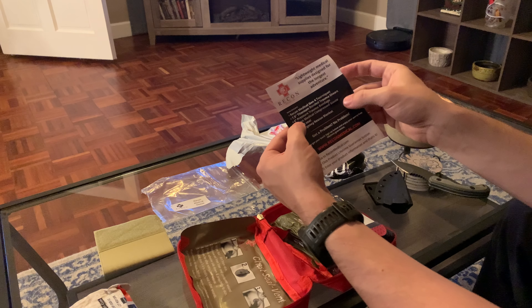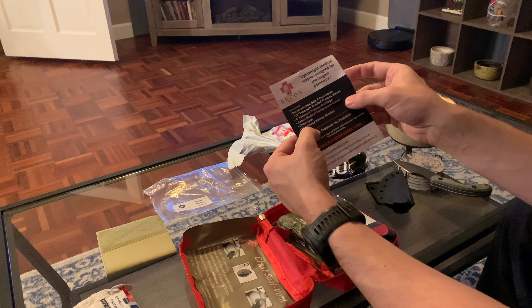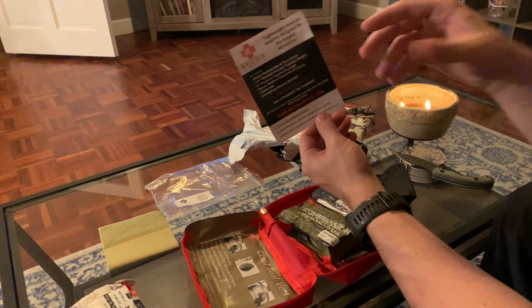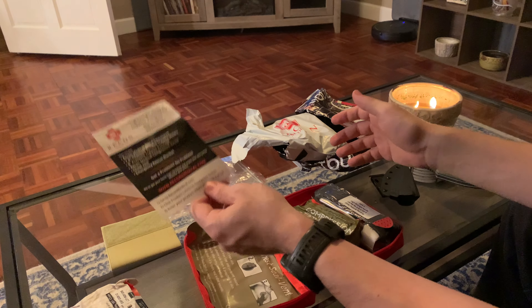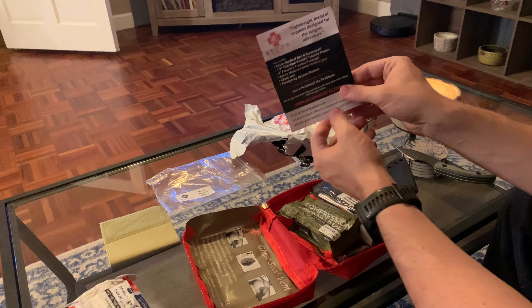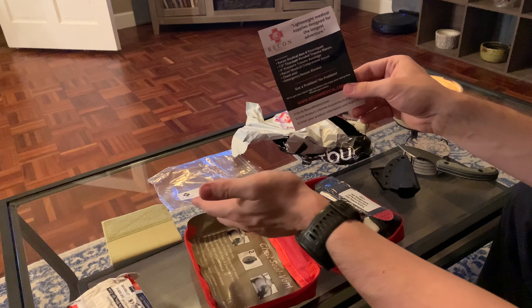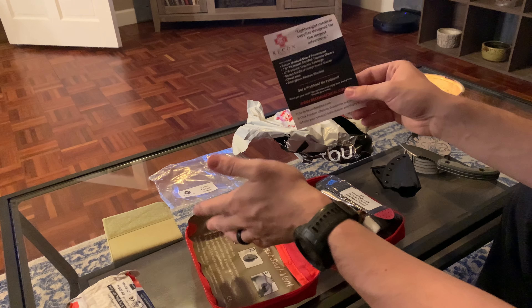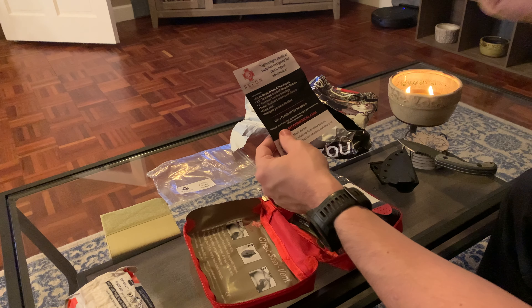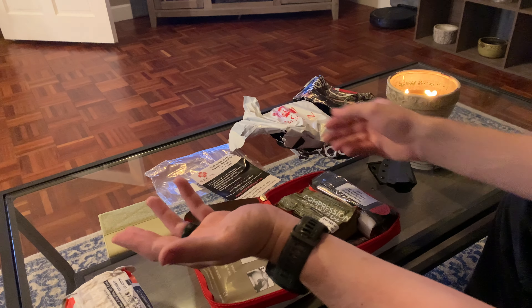There's a little card from Recon Medical — 'Thank you for your order, leave us a positive review.' Most definitely, I will be doing that. If you got a problem, no problem — get in contact with them and they will help you with everything. Sign it below and you get a worry-free lifetime guarantee. That's awesome — a lot of places don't do that anymore. So this comes with a Recon Medical Gen 4 tourniquet, 7.5-inch titanium bonded trauma shears, 4-inch pressure trauma bandage, Recon Medical compressed gauze, chest seal, and emergency rescue blanket.